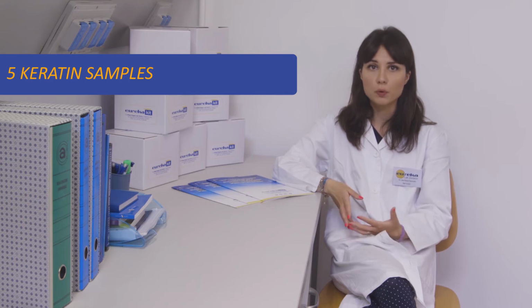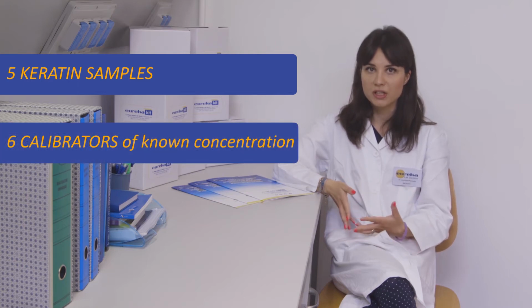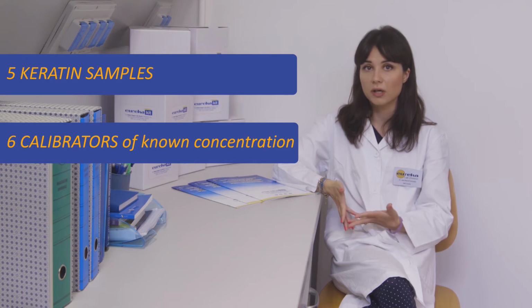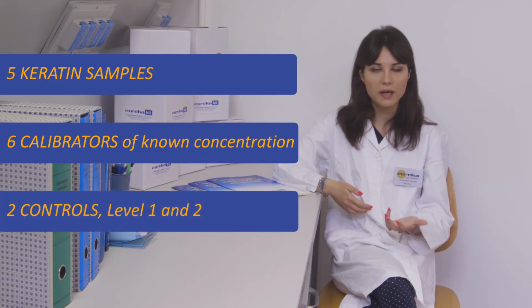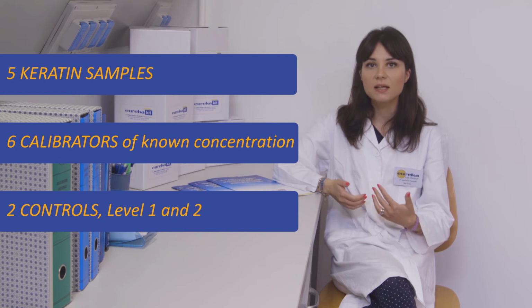Together with these samples, we will also analyze 6 calibrators of known concentration, which will help us to plot automatically on the calibrator curve, and 2 controls, level 1 and 2, that serve to check the validity of the calibration curve, and so the entire analytical session.